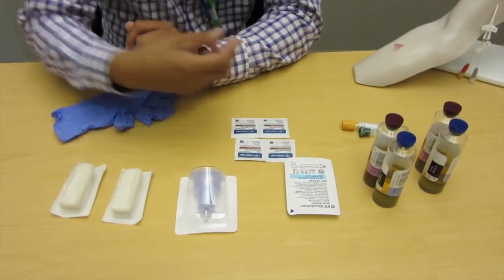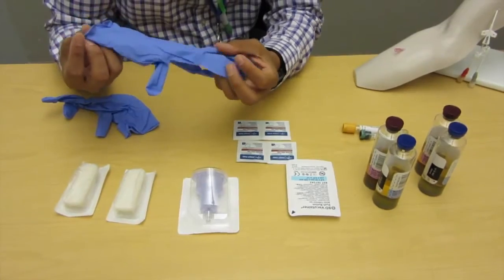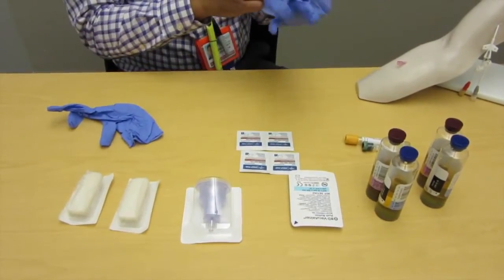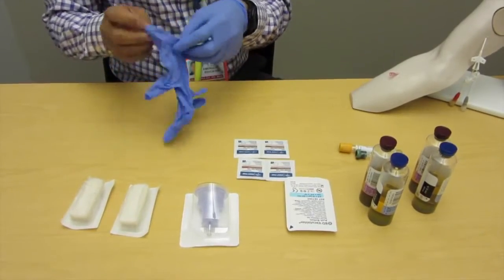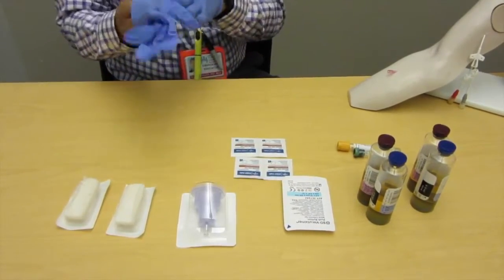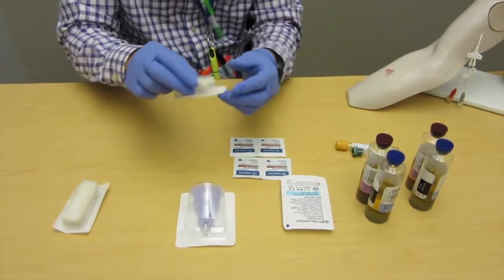In particular, make sure you use gloves. One thing that some people do when they use gloves is start scrubbing the site using our chloroprep.